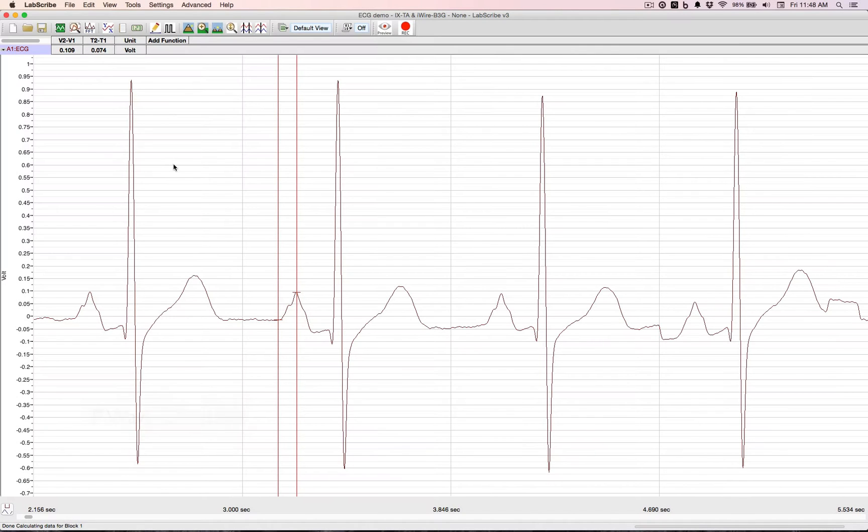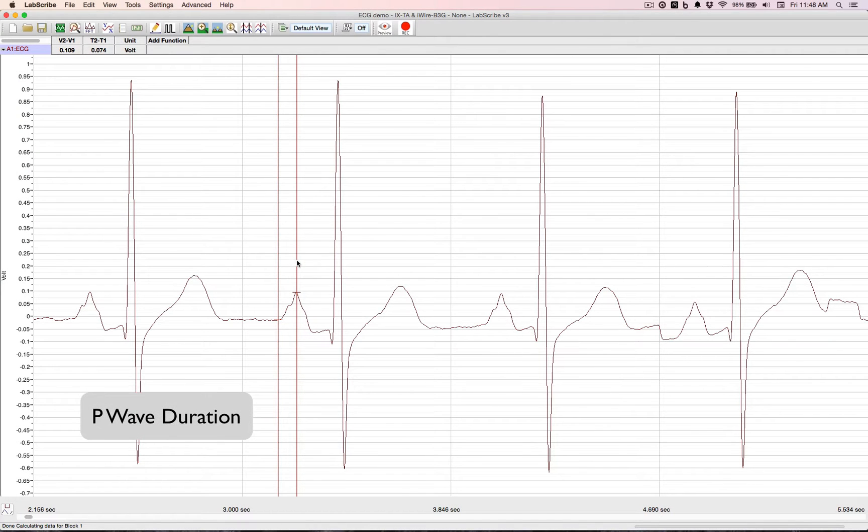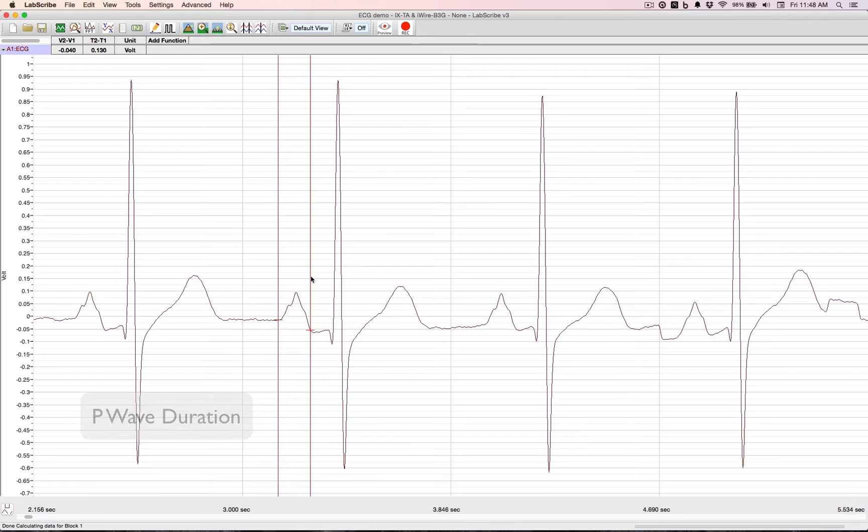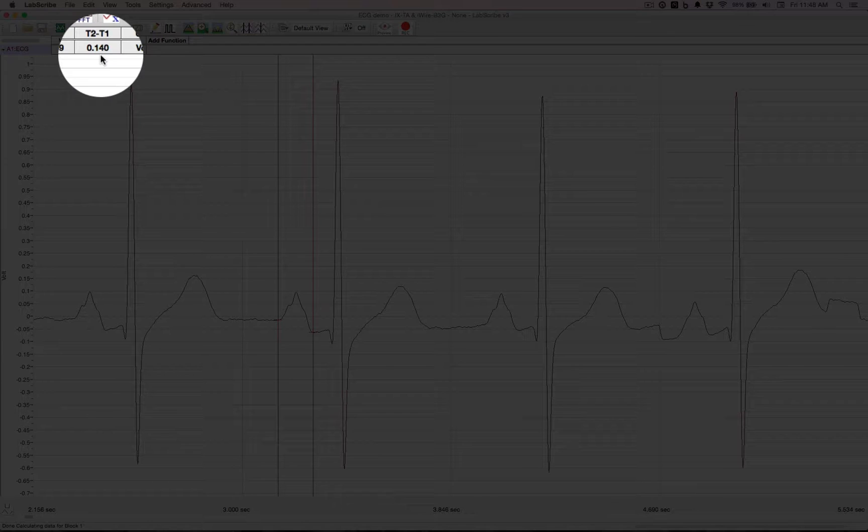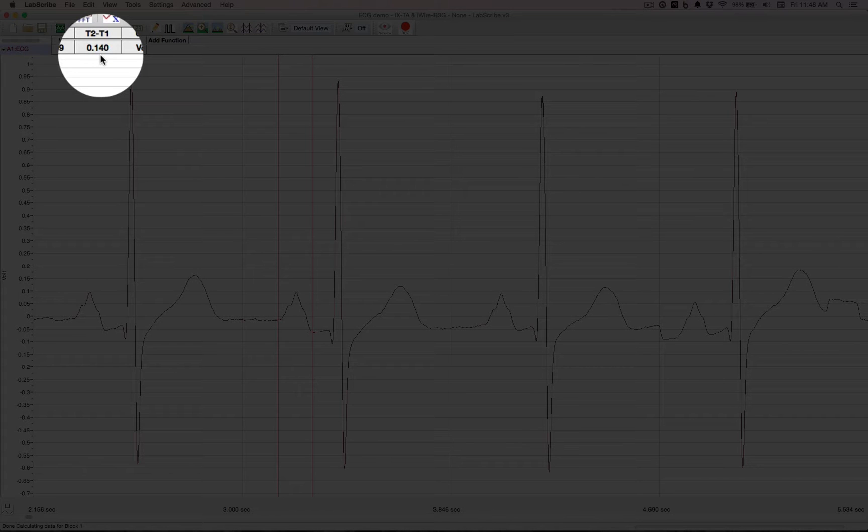To do a P wave duration, we just move our cursor to the other side of the P. That's 140 milliseconds.